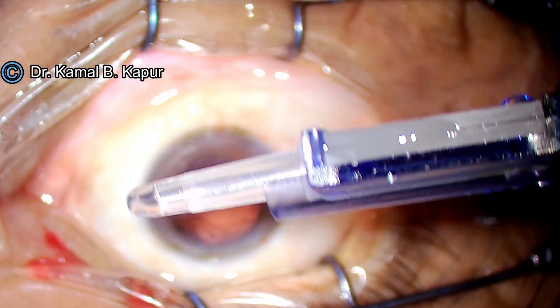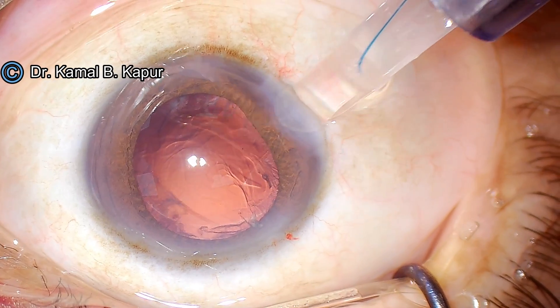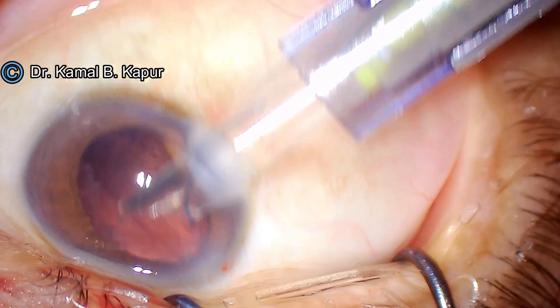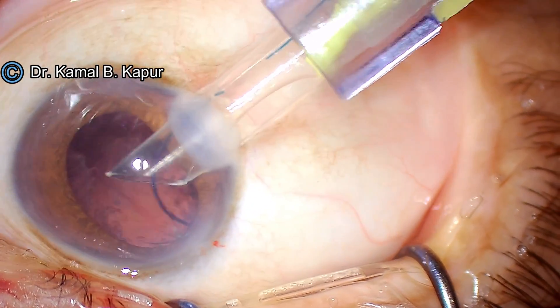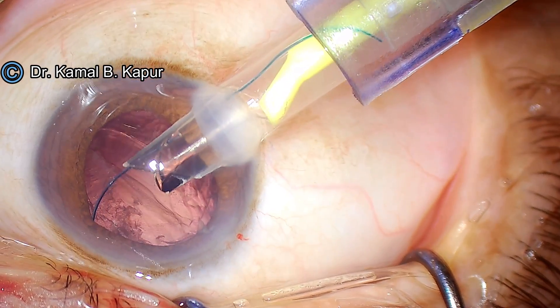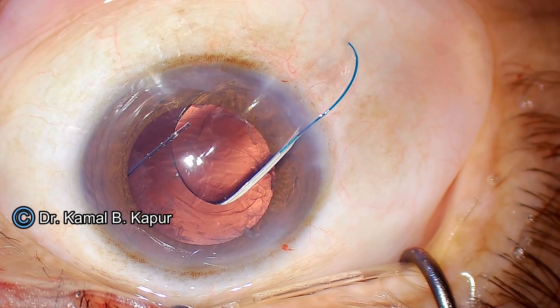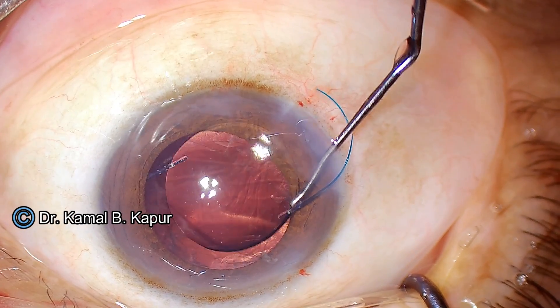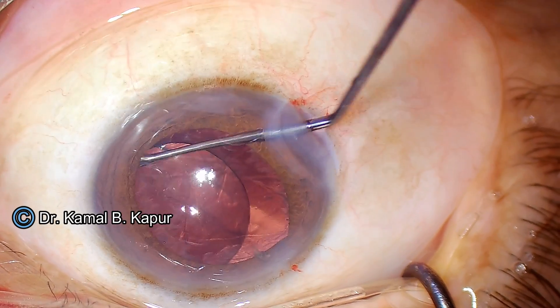We push some viscoelastic into the cartridge tunnel, making sure the anterior chamber is well inflated but not over-inflated. The bevel of the cartridge is turned toward the left, making sure the leading haptic goes right in between the oval capsule rhexis, anterior capsule, and the posterior surface of the iris. As the lens opens up, we start rotating the cartridge anti-clockwise. We wait for the haptics to open up, then use forceps or any instrument of choice to dial the lens in one single plane just behind the iris.